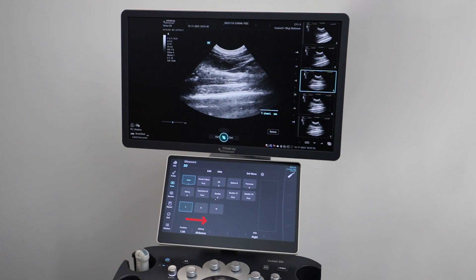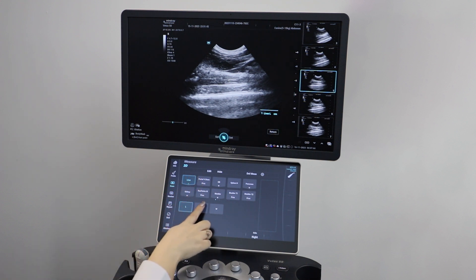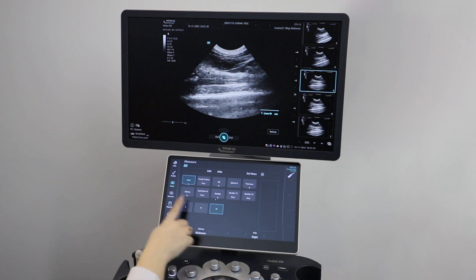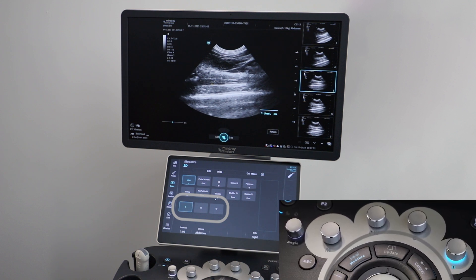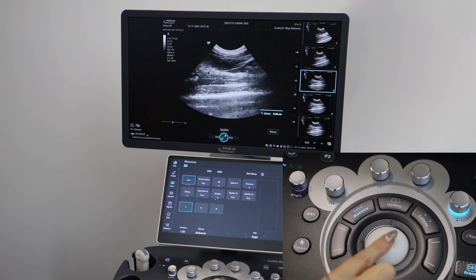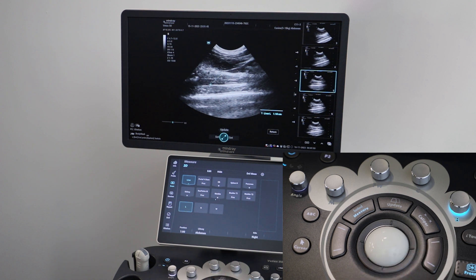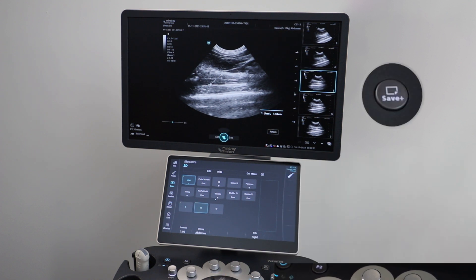For this example, I'm going to use bladder. You can select bladder height, depth, or TD and can select the correct label by pressing here. Once selected, you can then use your trackball to make your measurement. Click save to save your image.